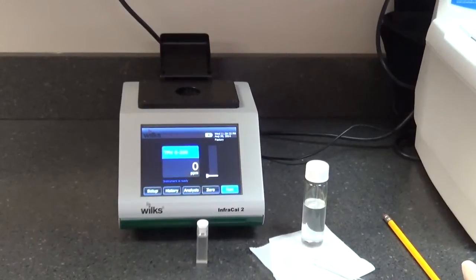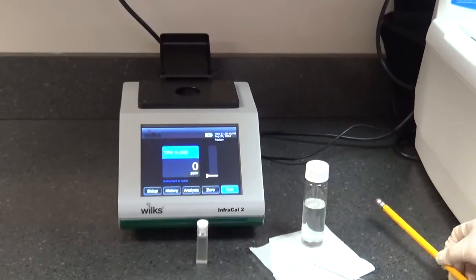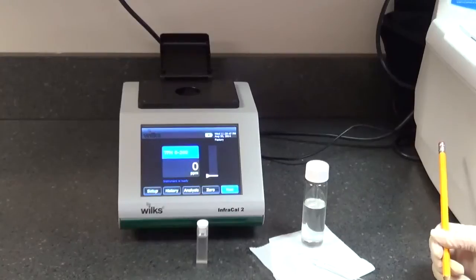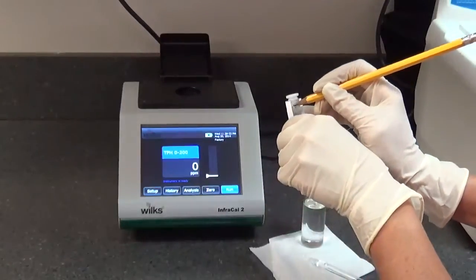For measurements below 2 ppm, it is important to use the same cuvette for zeroing and sample testing. It is also required to re-zero prior to each sample. The cuvette must always be oriented in the same direction. Mark the frosted side of the cuvette as an orientation reference.